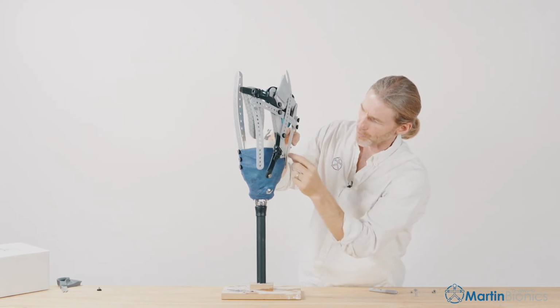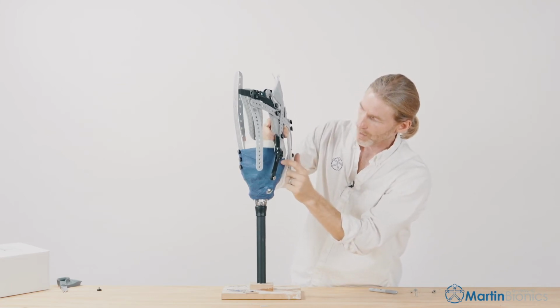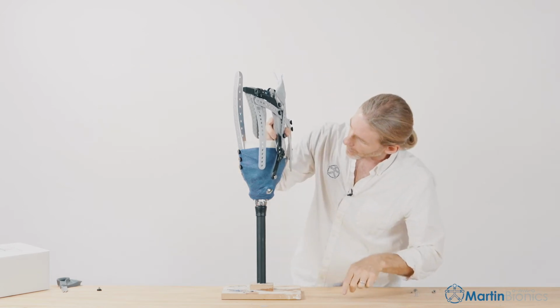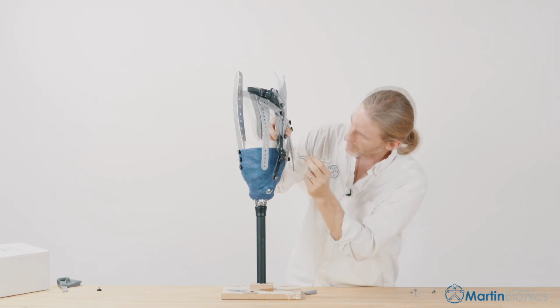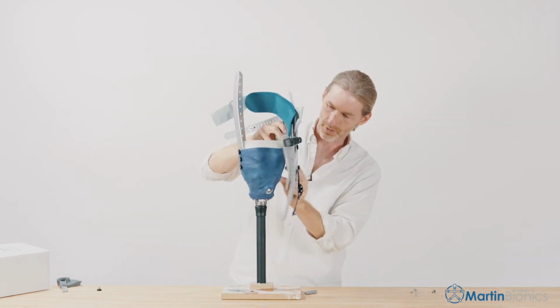I'm going to position the strut right over the top, height-wise, right over the top of the blue frame section. Line up with my hole. I'm going to mark where I drill. I'm going to drill at the same height of where my first full hole is, distal to where the frame sits. On this one again as well.